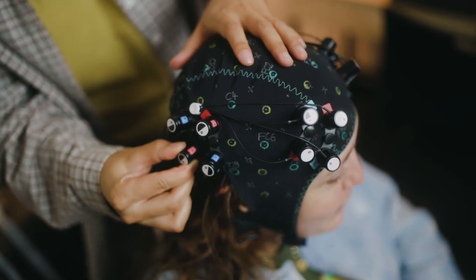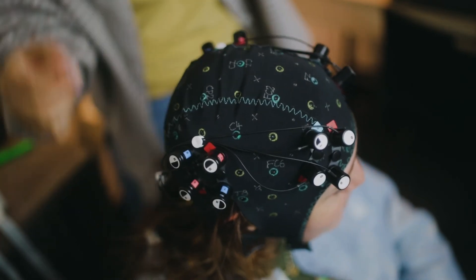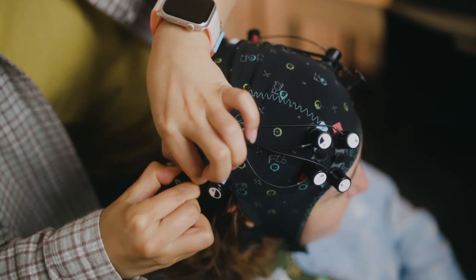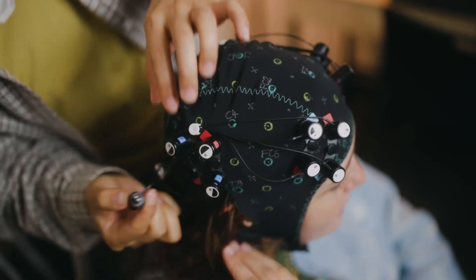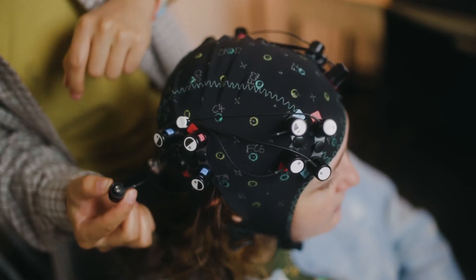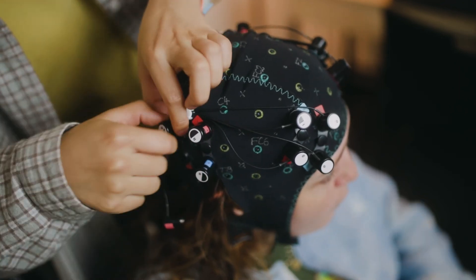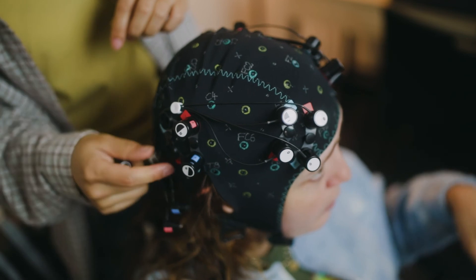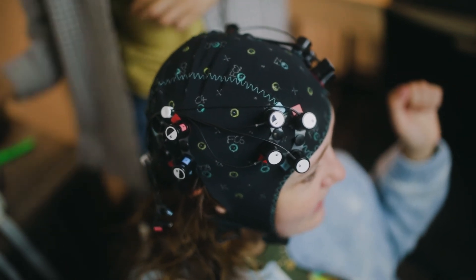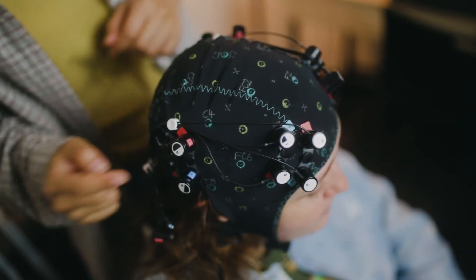If you accidentally pulled hair out of the hole of the optode, and even as you're trying to fix it some straggle hairs couldn't get back under the cap, that's okay. Just when you're pulling off the cap at the end of data collection, make sure you take off the spring topper before you pull up the cap, otherwise it will rip the hair and be uncomfortable for the participant. Be cognizant of that if you see some hairs are left out.